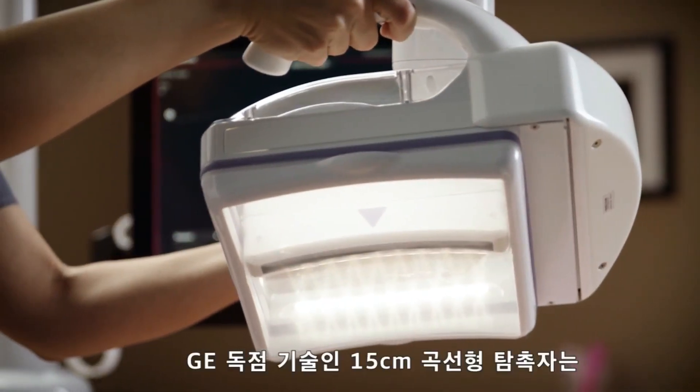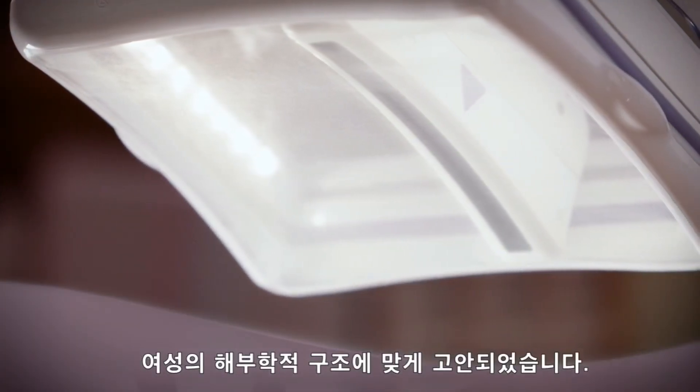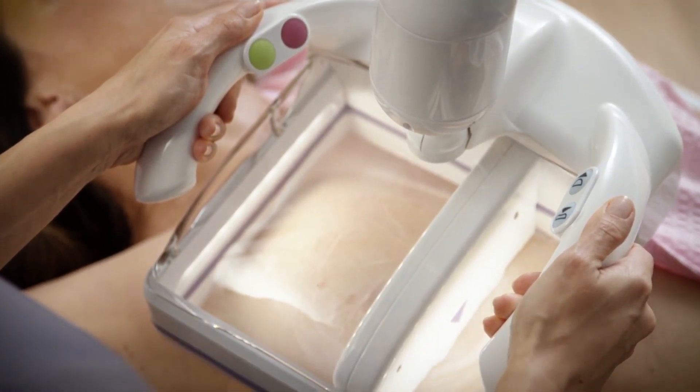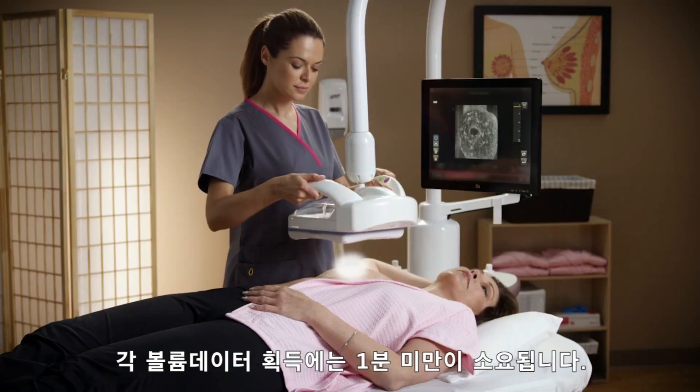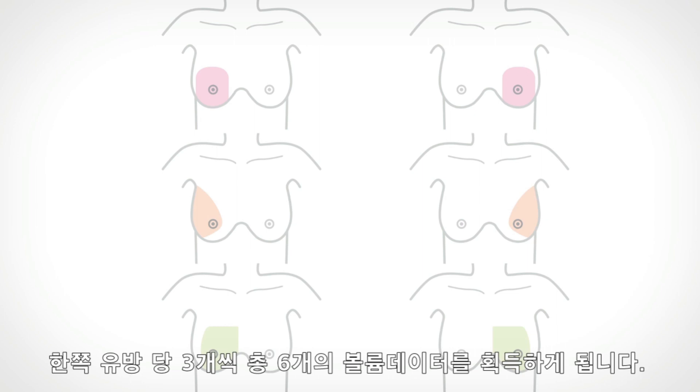The scan head assembly houses the exclusive 15-centimeter reverse curve transducer, which conforms to the female anatomy. The transducer moves from the inferior to superior edge. Each acquisition takes under one minute. Six volumes are required for a full exam, three per breast.